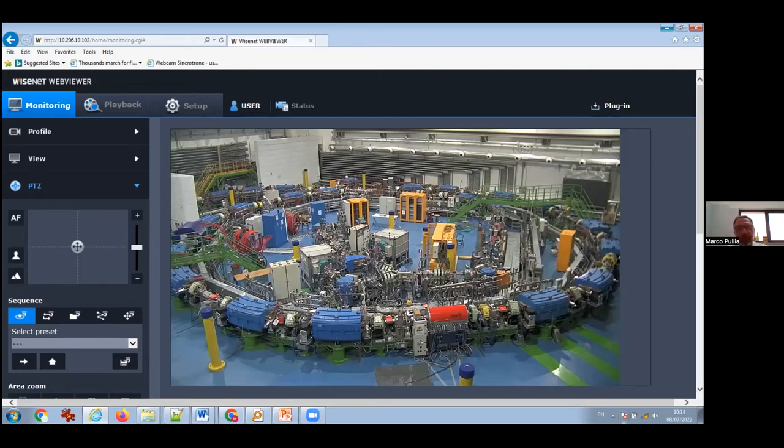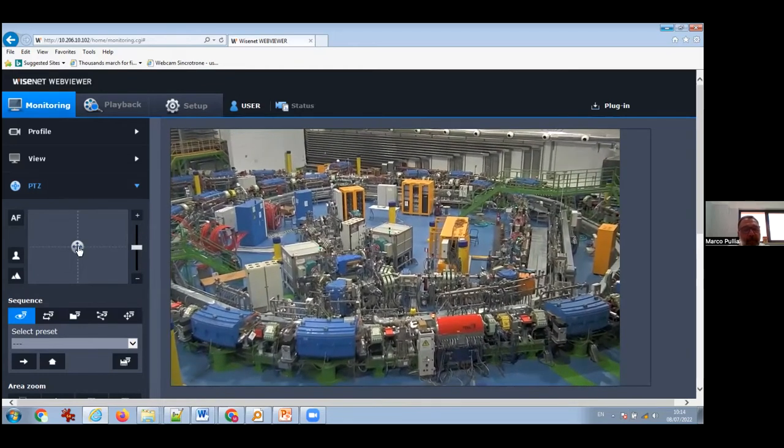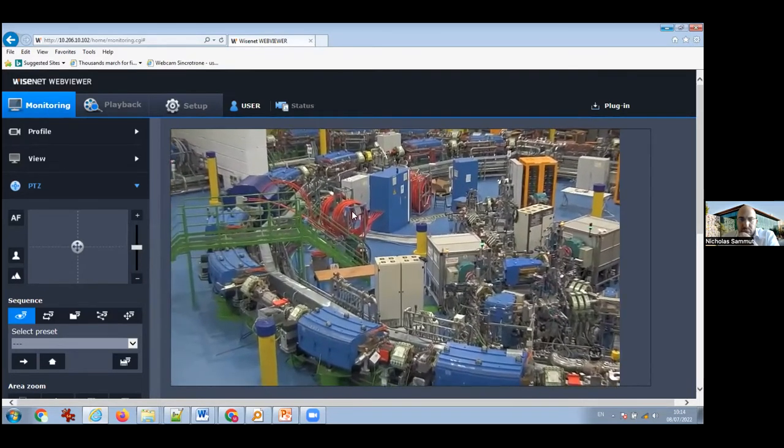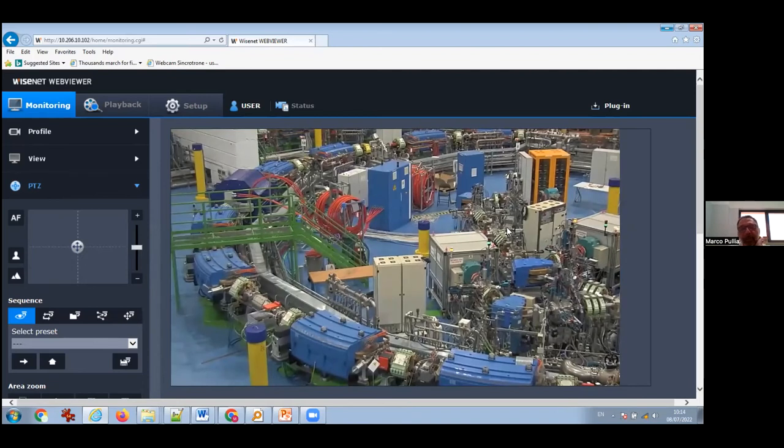You need these special pulse forming networks, which need cables to be designed. I'm not an expert in fast power supplies, but this is what it is. These two windings of coils are to shape the pulse to the tune kicker, which is here. Are there other questions?